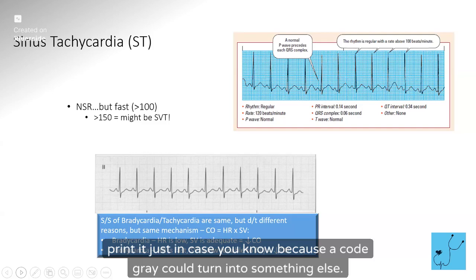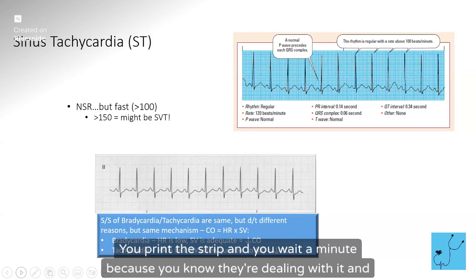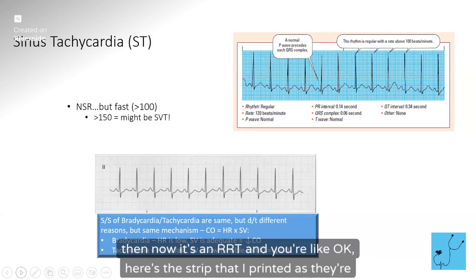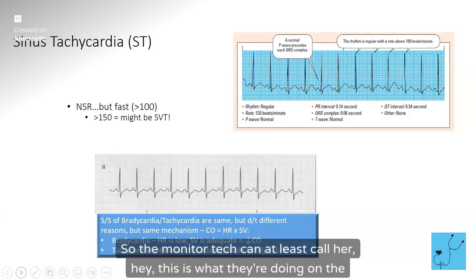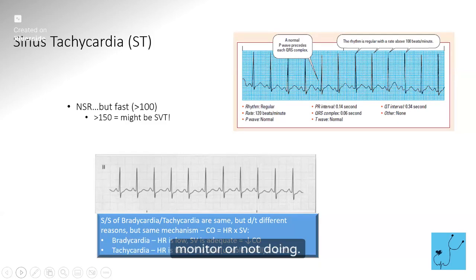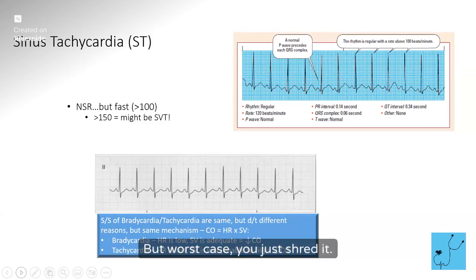Because a code gray could turn into something else. It's a code gray, you print the strip and you wait a minute because you know they're dealing with it. And then now it's an RRT and you're like, oh, okay, here's the strip that I printed as they're coming down the hall. Because that's why we put the RRT cart right there, so the monitor tech can at least holler, hey, this is what they're doing on the monitor or not doing. So in that instance, that would be a good thing. But worst case, you just shred it. Yeah. It's a good question.